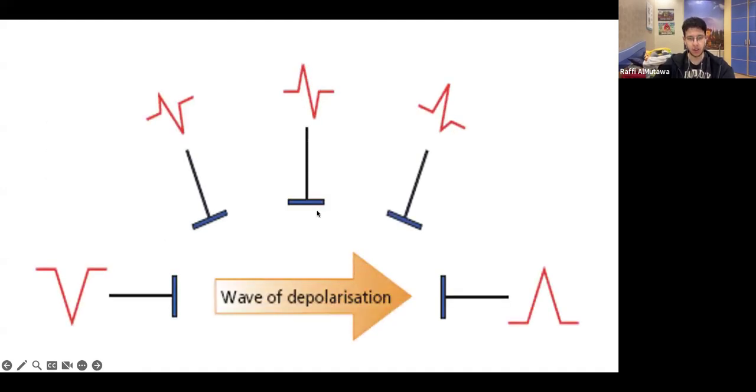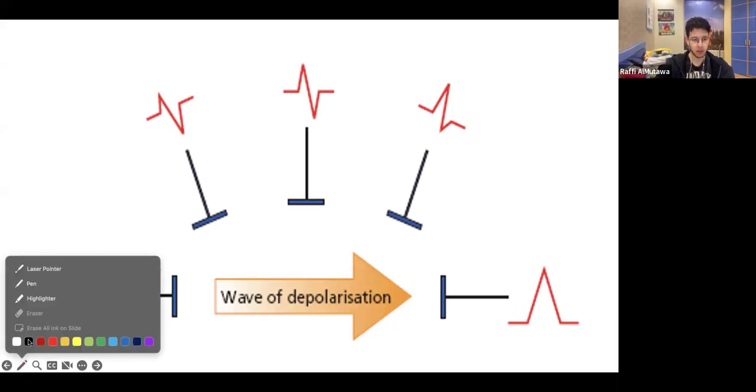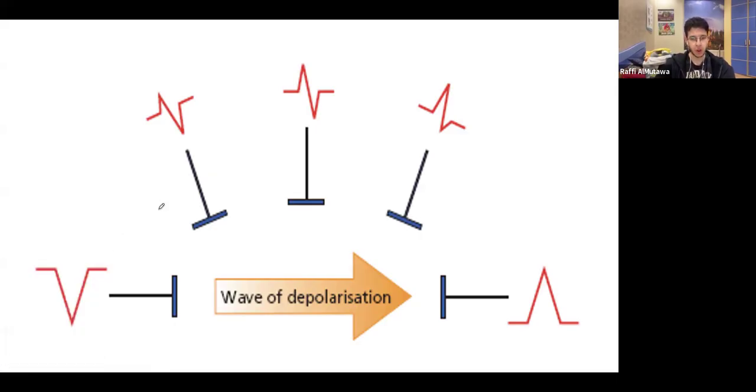Okay, so here, this is a picture showing you the wave of depolarization. One of the very difficult things that people don't realize about ECGs, and it's not really difficult, it's just no one takes the time to realize this, is the way ECGs work is you have a person, right? And then you place pads on a person. And this pad is connected and it provides an electrical signal. Basically, what this pad represents is it's going to pick up on the electrical activity of the heart.